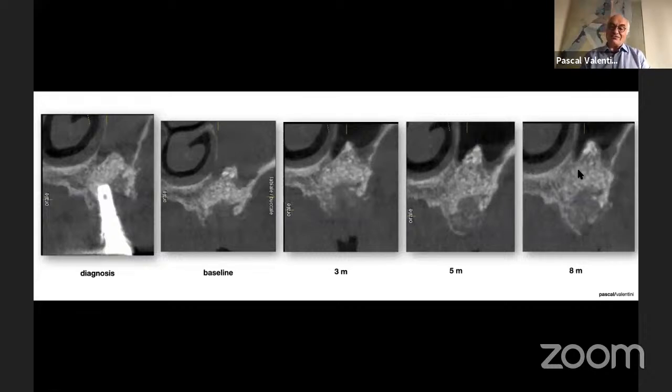At that time, we have the opportunity to take a biopsy here in order to check the quality of the healing. We have two different areas. Number one is the previously grafted area, and number two is the healing area, the healed area.